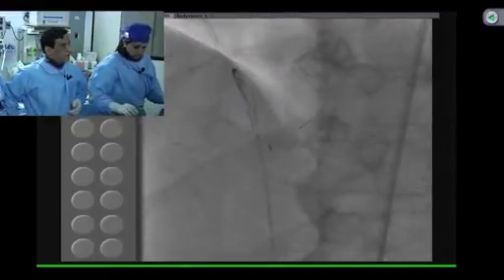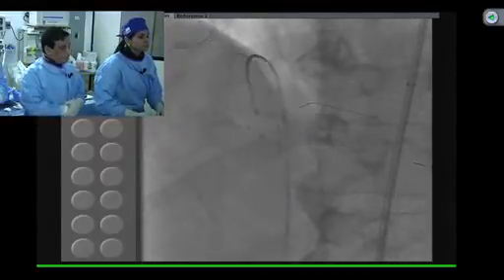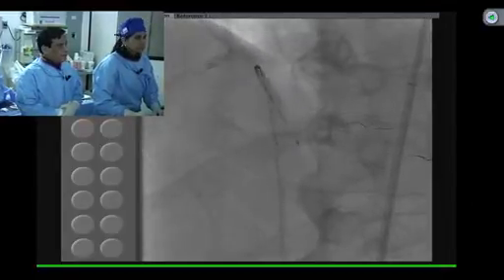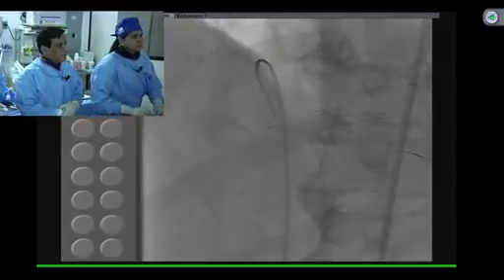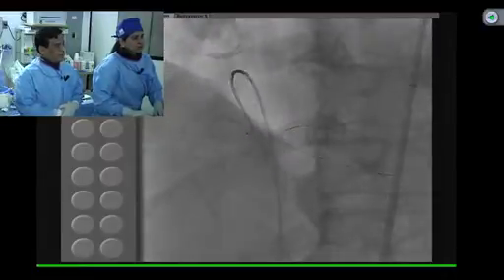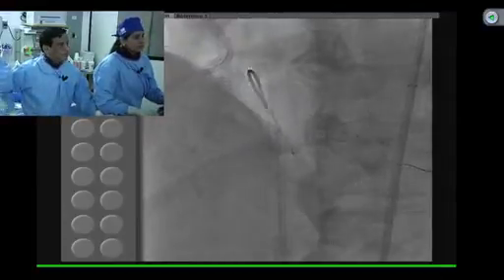Should have gone with the shorter stent. No, but there is disease up to mid. If need be, we can go with the 2.75/23. I don't think we should put another layer. I would just go to the ostium of the PDA. This is not going to be tough. Okay, yeah, a 2.75/23 XIENCE will be okay.